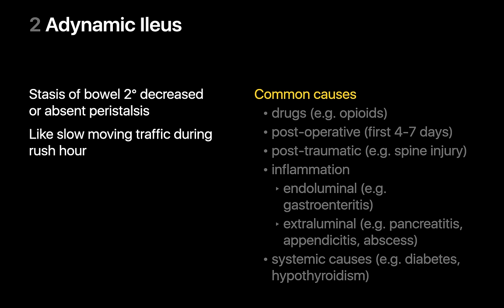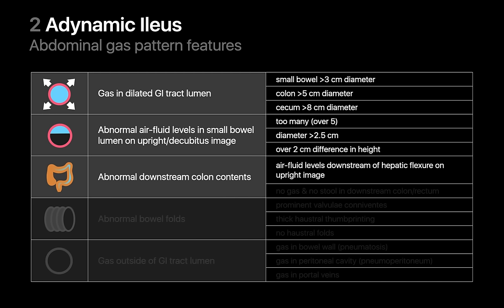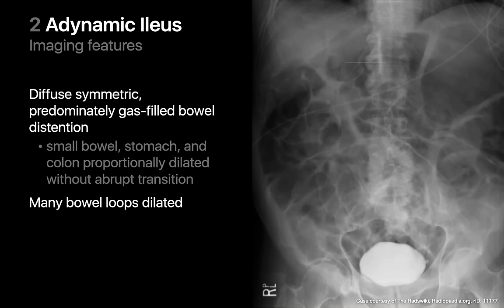The x-ray findings of adynamic ileus include gas or air-fluid levels in distended small bowel, cecum, and colon, but the distension will usually be diffuse and extend all the way to the rectum. In this example of adynamic ileus, the entire GI tract is gas-filled and diffusely distended, including the sigmoid colon and rectum, without a difference in severity of distension upstream versus downstream — unlike mechanical bowel obstructions, where the downstream colon is collapsed and imperceptible while the upstream GI tract is distended.